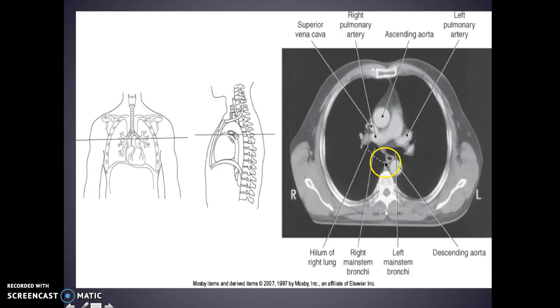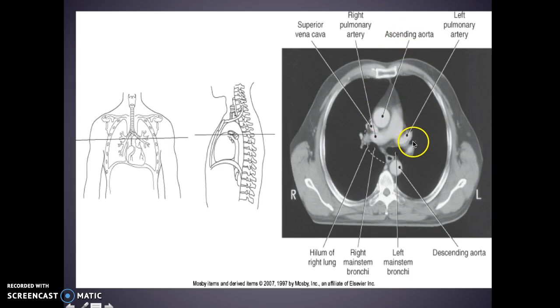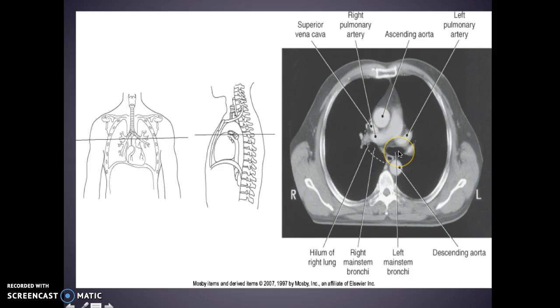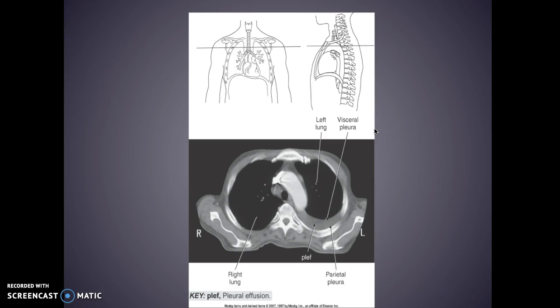This line again is your right hilum. Here's your ascending aorta with your left pulmonary artery, this is your pulmonary trunk, and your descending aorta. This is your left main stem bronchus and your right main stem bronchus. Your superior vena cava — you're going to see that a lot. It's going to be a good landmark because it's going to have contrast in it and typically be a little brighter than everything else.